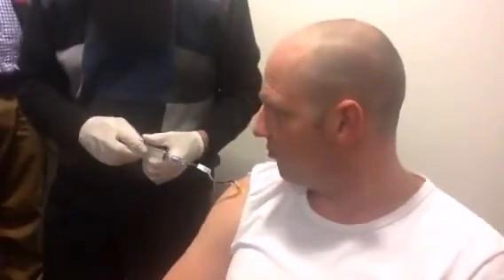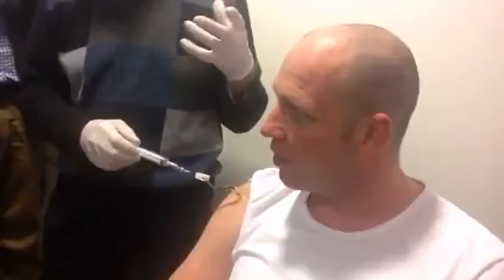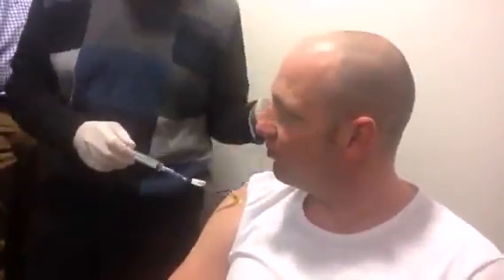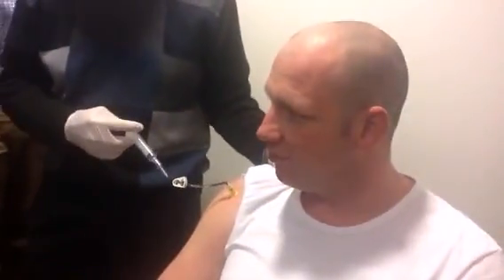Now this makes people sick sometimes, so maybe they don't look. People faint with shots, and I've seen some people — when they see the blood, they go, oh. So you're okay? I'm okay. Alright. You just have to remember that some people don't like the sight of blood coming out.